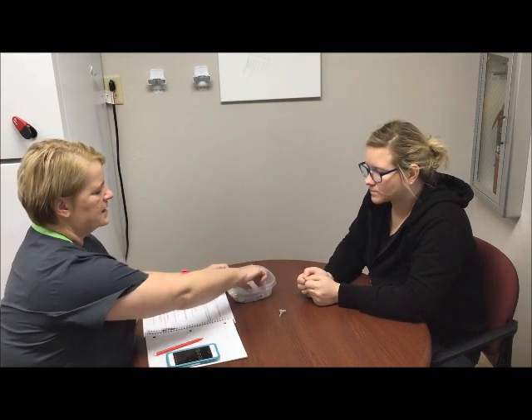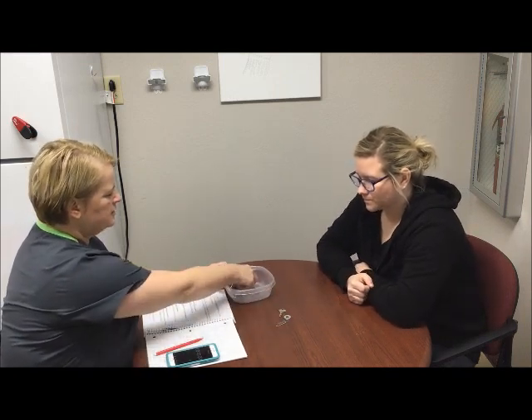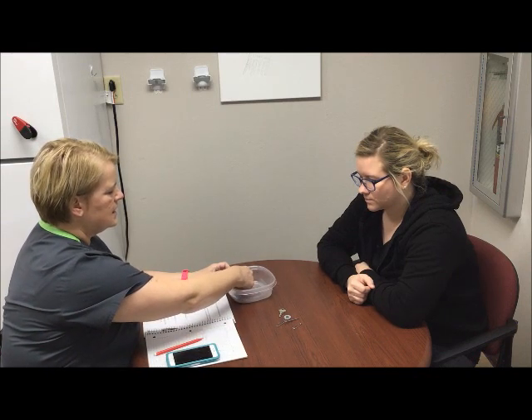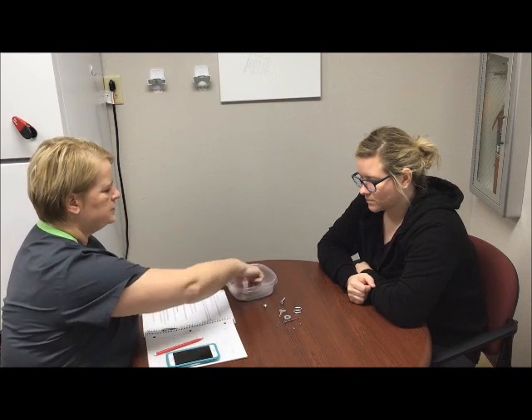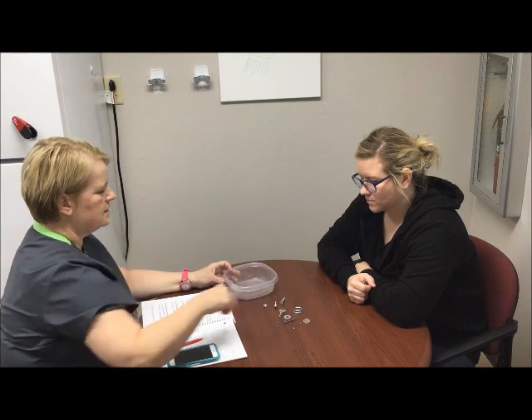I have a container here and the items are going to be similar. I've got a key, a washer, a paper clip, a nail, a safety pin, an S-hook, a screw and a bolt, a quarter, and a wingnut.